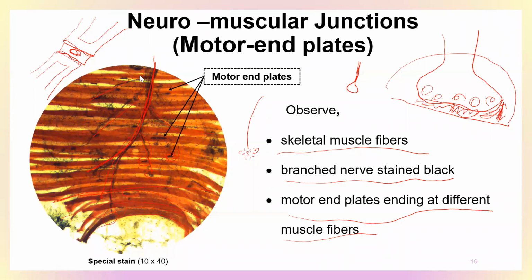No, smooth muscle cell is not bifurcated. Lakshika madam will kill me if you tell that, right? There is no bifurcation in the, sorry, there is a slide. At the tapering end, there can be small division, right? That's all. It is not branching, sorry. It's bifurcated at the end, right? So she will teach you, okay?